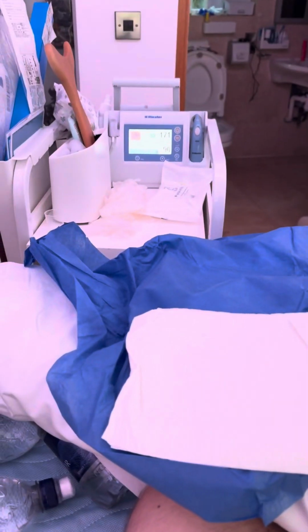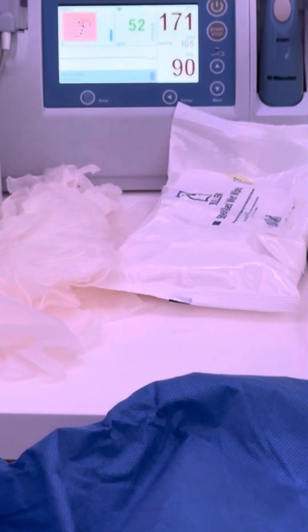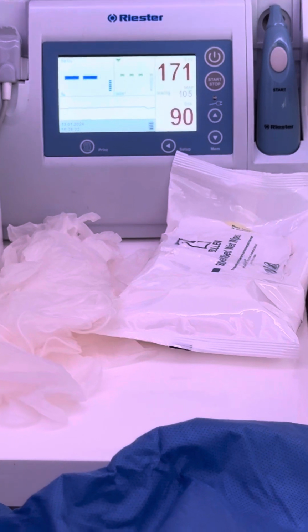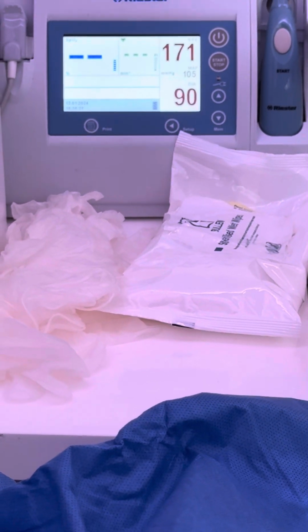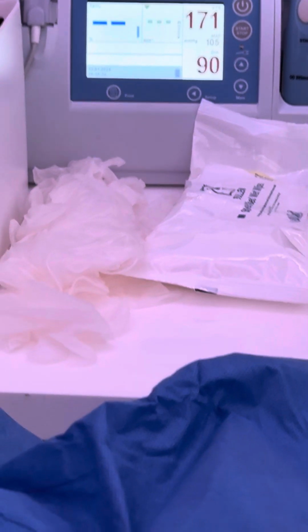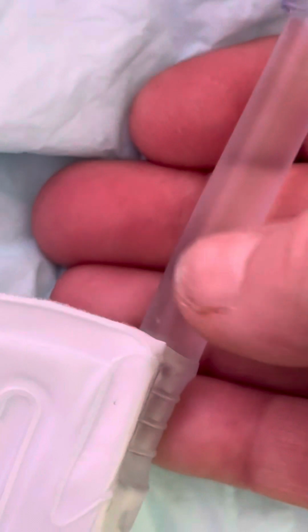I've got no overgranulation. But what I have got is still a bit of a high reading, which is 171. So I'm going to watch that now for the next 10 minutes. I'll do 2 more readings. However, what I have got is a flow. That's what I'm saying about clamping, so that the clamp does not pull that catheter in any way, shape or form. And it's warm to touch, so that's lovely. And there's nothing in the bag, so I'll do that.